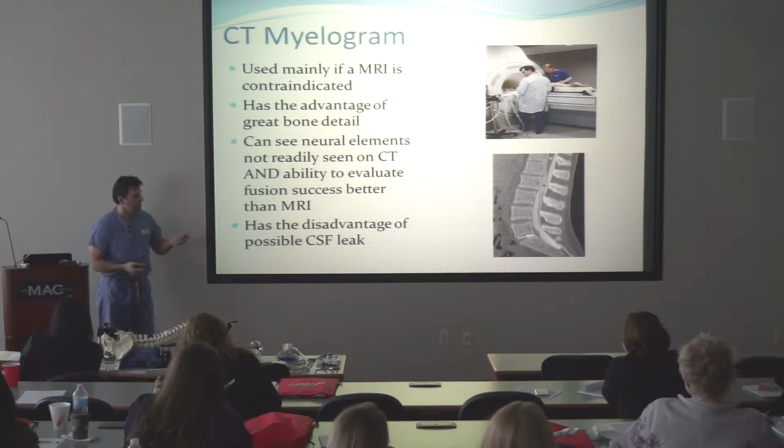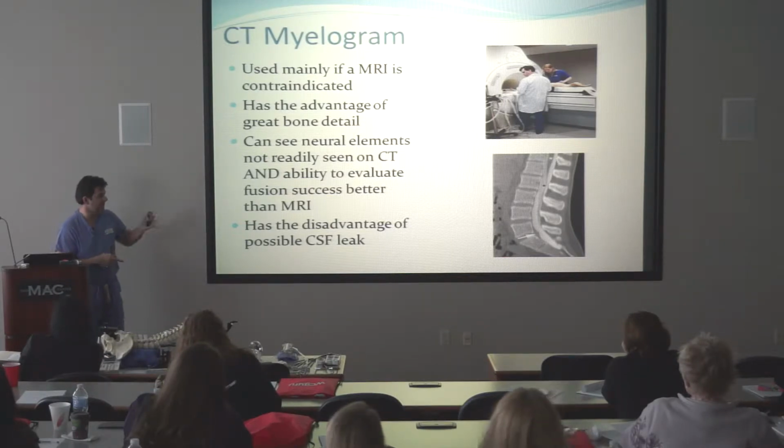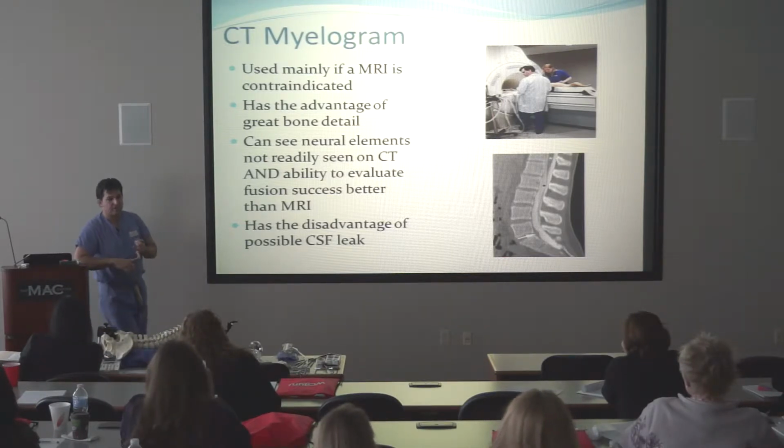All right. Again, a couple of issues that are disadvantages of this study. One is it's an injection, it's a spinal injection. You can get a CSF leak, you can get headaches, complications. That dye that's in there can irritate the nerves, and they can have a problem from that.